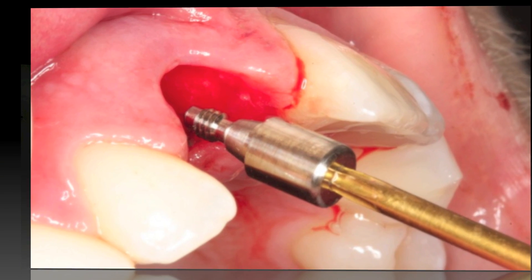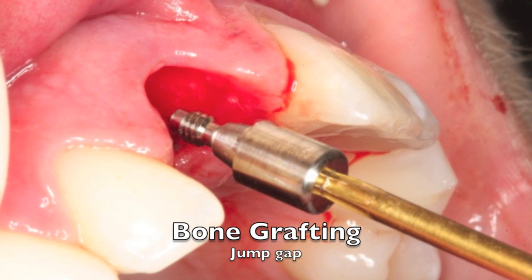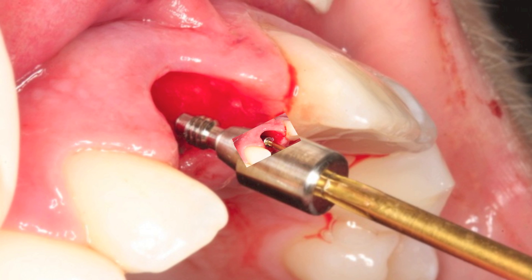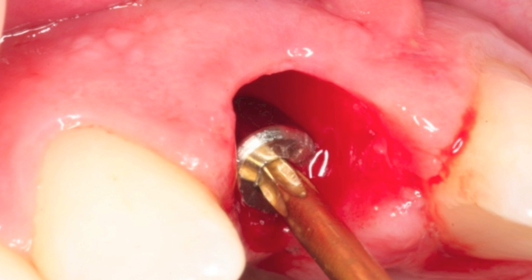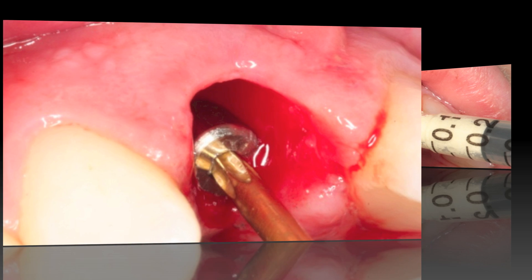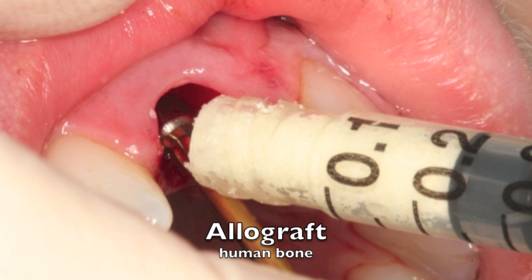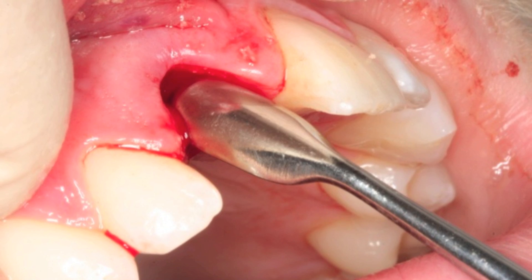Once this is done, I start to go towards bone grafting. I like to place a healing abutment for a bridge — I use a bridge healing abutment because it goes to the outside of the implant, meaning the bone graft won't cover where I want to put my new temporary. It lines up the bone on the outside of the implant, then I can come back and place my temporary very easily. In this case I used some allograft and placed this in the buccal jump gap and around the implant, then used the bone spoon to shape it and push it up around the implant to make sure the buccal bone doesn't collapse.